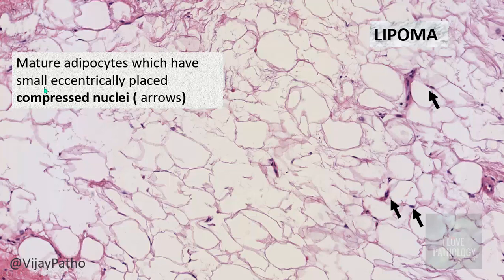Microscopically, what you find is all mature adipocytes which have a small eccentrically placed compressed nuclei. These adipocytes have an eccentrically placed small nucleus and all the cells have an empty-looking appearance. The fat present in these adipocytes is dissolved during tissue processing, so what you see is only the empty spaces. Some adipocytes show no visible nuclei at all.